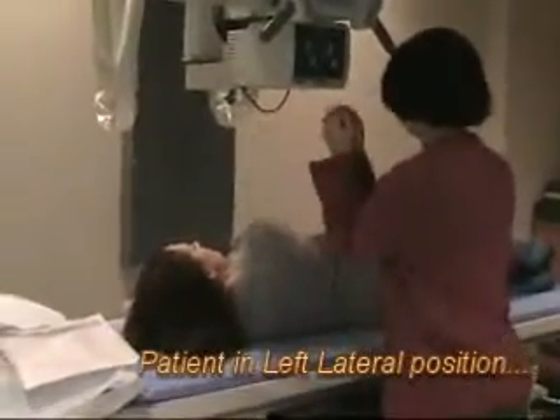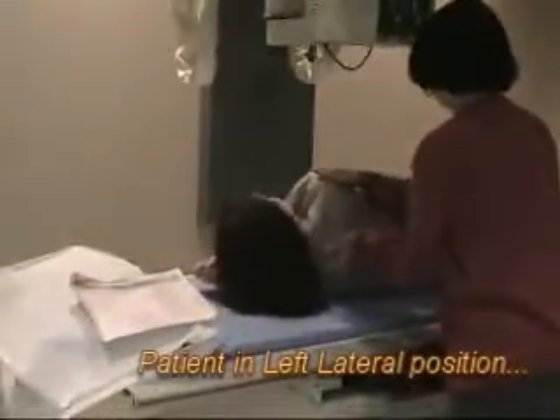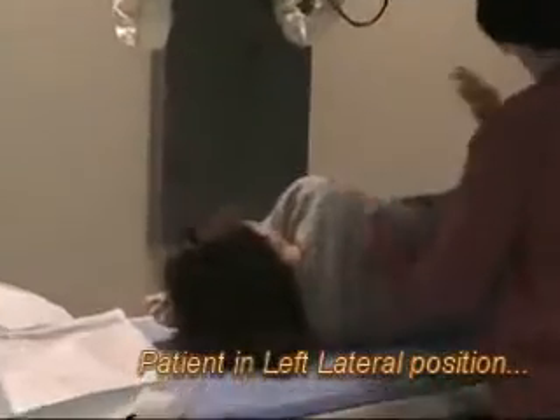I'm going to put both arms just kind of, perfect right angles with the elbows.